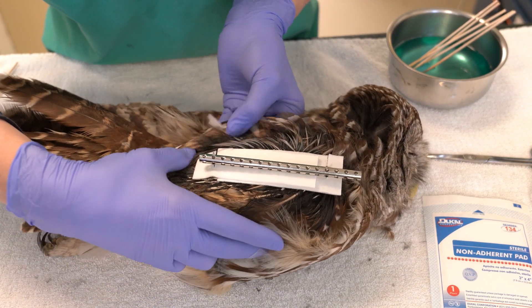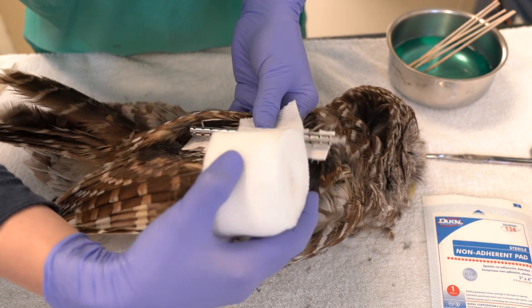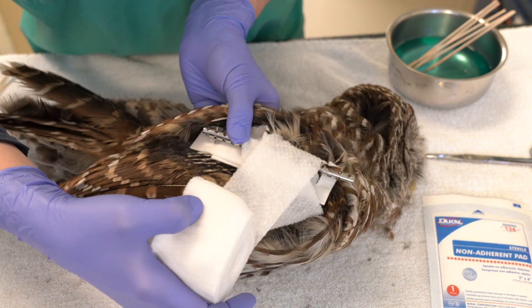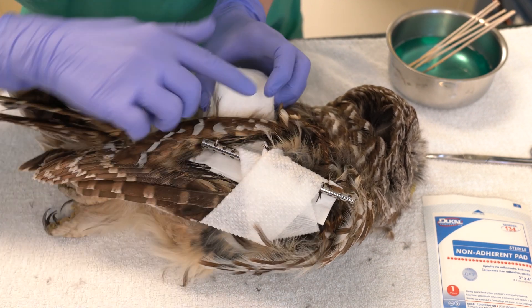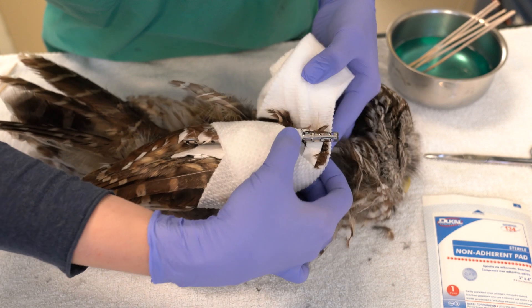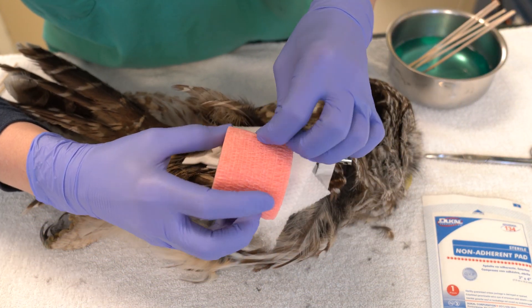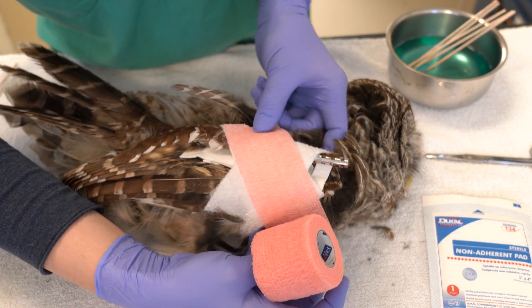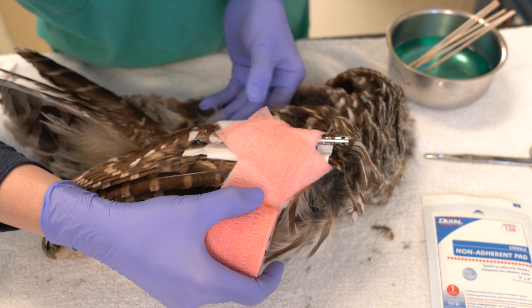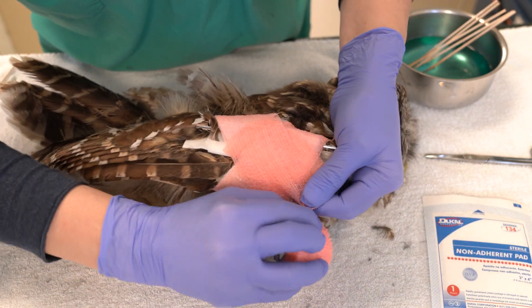A figure of eight bandage should then be applied over this non-adherent bandage. This bandage should be changed every day for the first three to five days after surgery. The first loop of the bandage should be placed around the carpus, then under the axilla region including the patch of scapular feathers, ensuring the wing sits above the elbow and is held in a normal resting position. The bandage should be changed once daily as long as active discharge is occurring, and can be removed when this has resolved and there is not a significant wing droop present. This is typically within the first three to seven days after surgery.